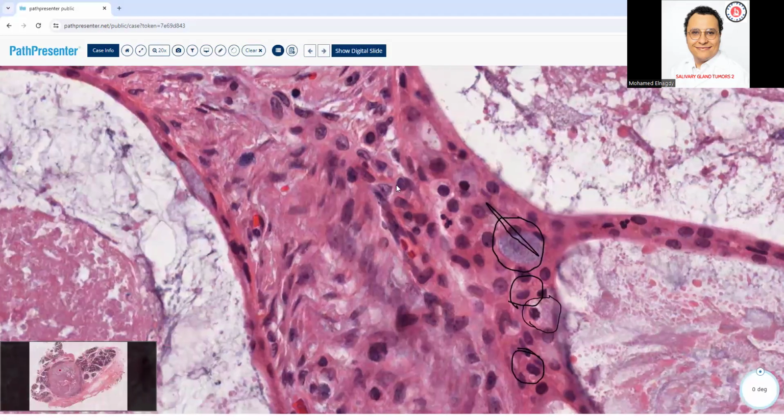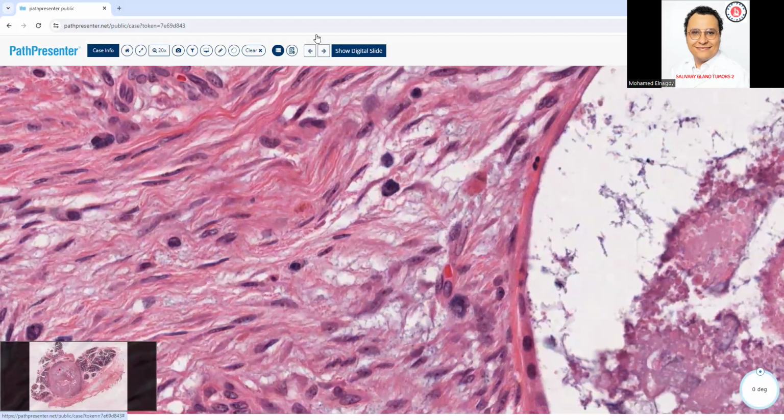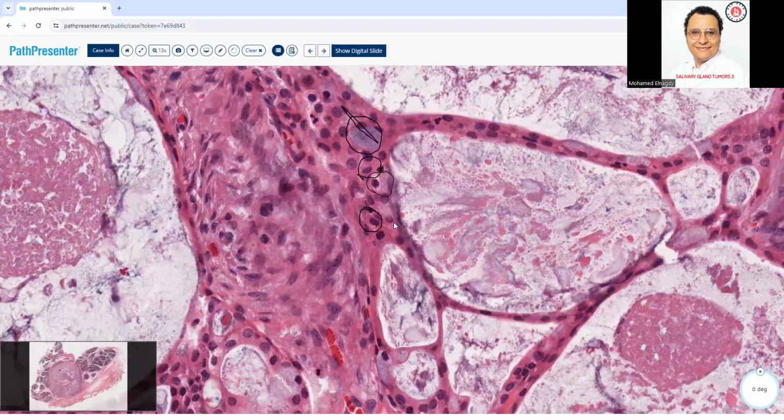So this is mucoepidermoid carcinoma. Do you think it is mucoepidermoid? Because I have also Noor saying secretory. Well, secretory didn't have mucus cells. And with this kind, let's throw some stains. Mucinous. Yes, Mohammed.